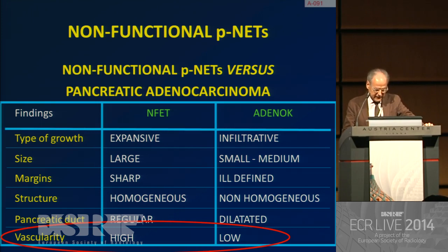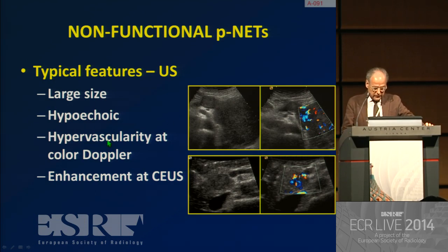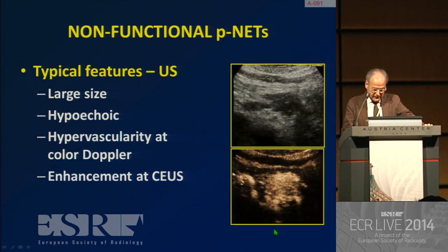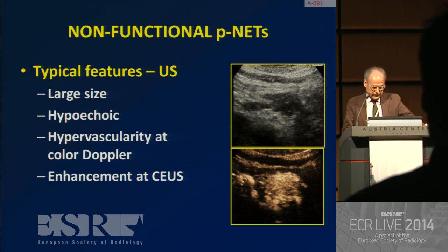Vascularity is probably the most important imaging finding to make the differential diagnosis between non-functional PNETs versus pancreatic adenocarcinoma. It is typically elevated in case of this tumor, low in cases of adenocarcinoma. At ultrasound, we will see relatively large masses, hypoechoic, with hypervascularity that can be demonstrated already at color Doppler, but can be better demonstrated with contrast-enhanced ultrasound. With contrast, you see a definite increase of the vascularity of this pancreatic mass, which is typical for this type of tumor.